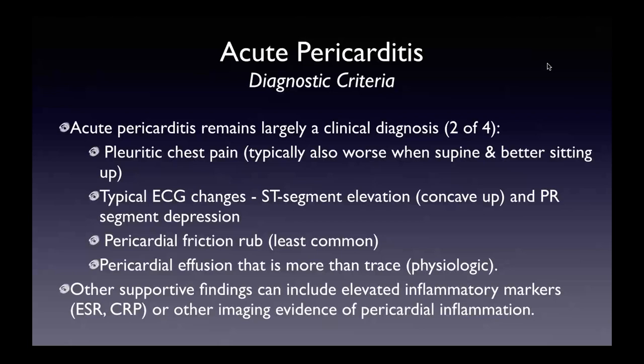And when I'm on the ward, I tell the PGY1s and trainees that I remember when I was a cardiology resident many moons ago that my mentors, people like Luigi Casella, Randy Watson, would say that if you have ST segment elevation, especially with concave up in leads one and two, then think about acute pericarditis, because it'd be unusual to have an ST segment elevation myocardial infarction involving both the inferior leads and the high lateral leads.